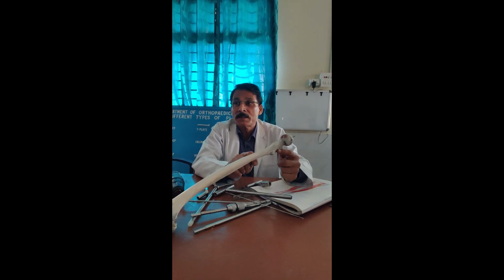It is tailor-made. Tailor-made on what basis? One, where is my head locking? The tip: am I in the subchondral bone support? Am I in the central part? What is the TAD? What is the condition of the bone? And what is the condition of the posterior part? You have to calculate all of it. Then, depending on that, you can go for partial weight bearing, full weight bearing or non-weight bearing. So this entirely depends on so many factors, not a single factor. So this is how.